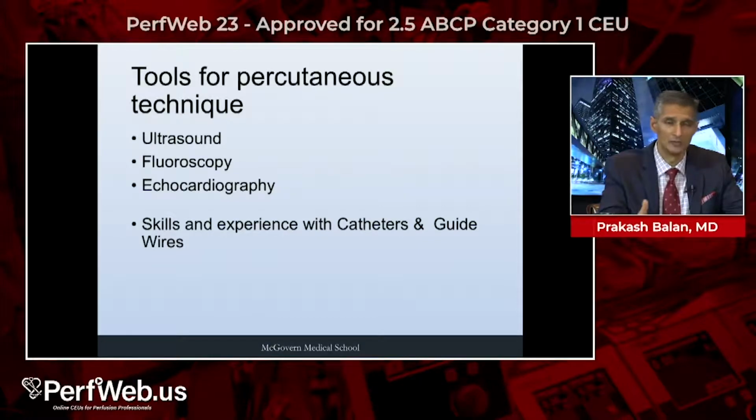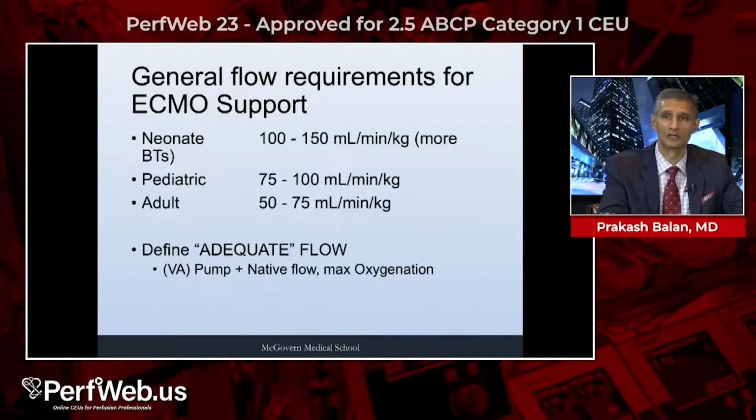patients on ECMO: fluoroscopy, ultrasound, echo, skills with catheters and guide wires. We were just talking about the importance of being facile with catheters and guide wires. It is absolutely essential in the ECMO space that surgeons and interventionalists have these tools in their toolbox.